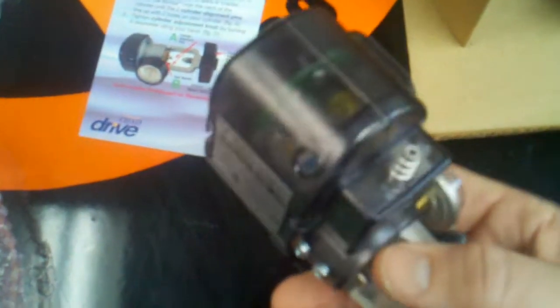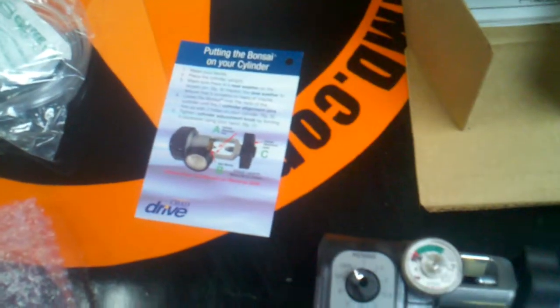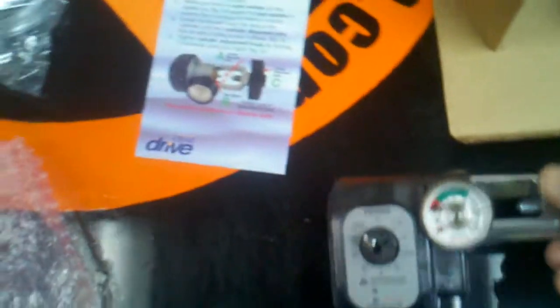It weighs less than a pound. I'm holding it in my hand right now and it's one of our popular choices on our website. What you would do is place it right on the tank — if it's post, it will just go right on there with a toggle. You obviously also need a key, which is this, and we sometimes include these if you ask for them along with the conserving device.